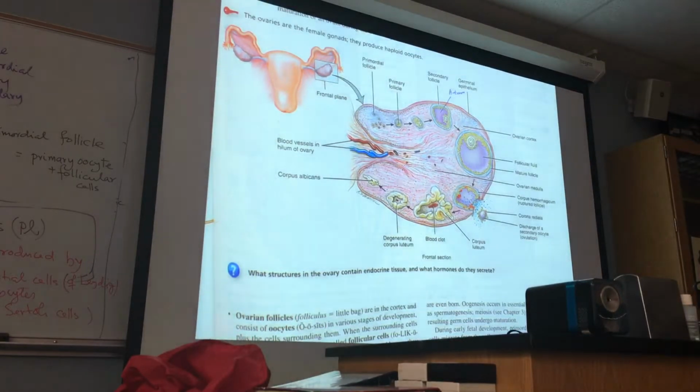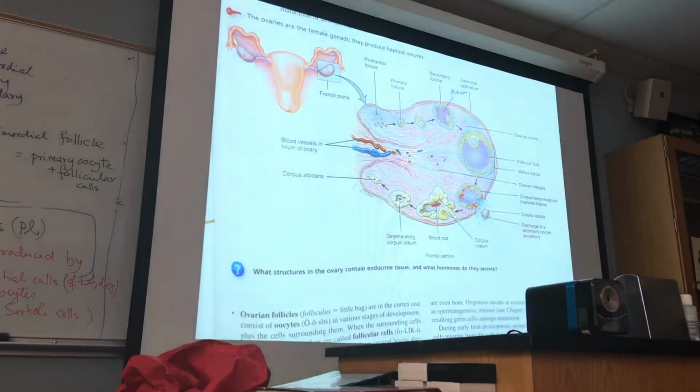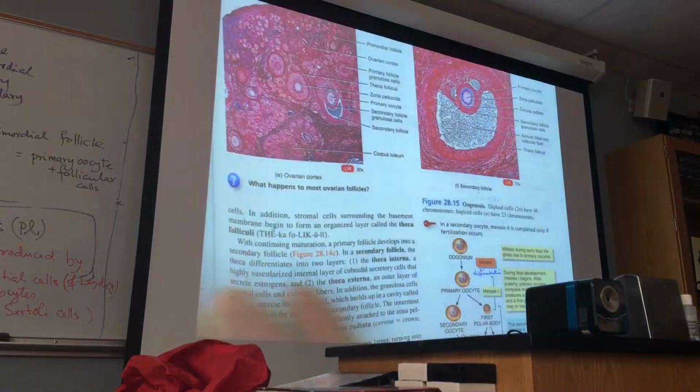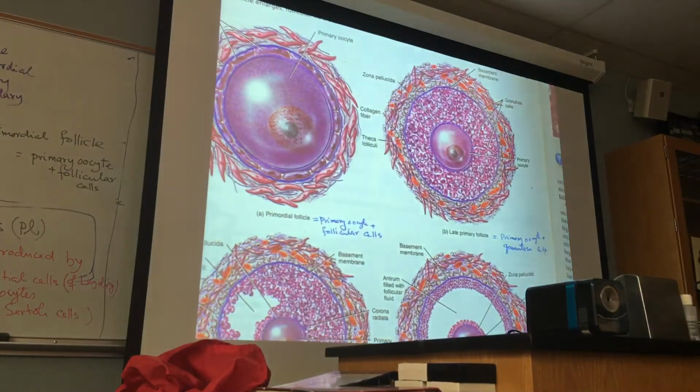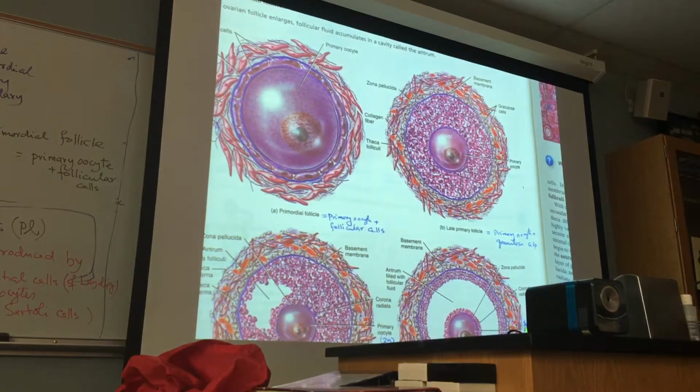Okay. Now, let us look at the primordial follicle. How does it look? Let me have these two side by side.